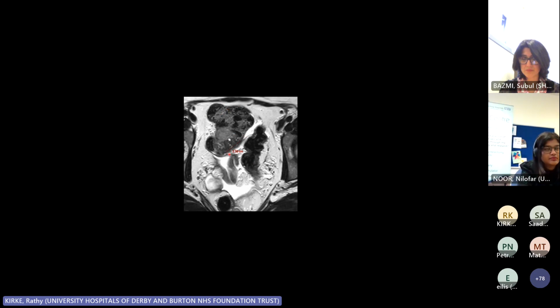That's a bit of poo in the bowel, but this is endometriosis on the surface of the cecum. Again, I don't think I'd be able to identify this with ultrasound or on CT. This lady's had previous CTs. It's very difficult. So we look for endometriosis, we find it. So this was quite an interesting case for us.